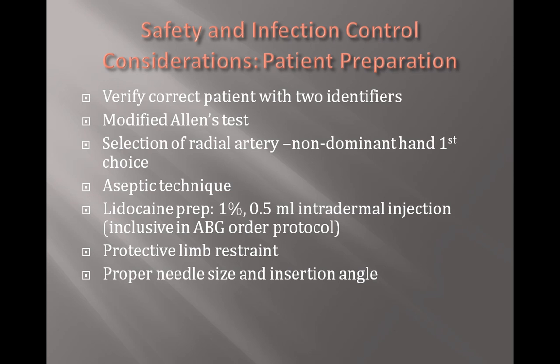So, a 90-degree angle is acceptable for femoral artery punctures, but not for a radial artery puncture. You'll also want to be cognizant of post-puncture care needs and plan accordingly. The primary concern here is to build in enough time to support your patient and maintain post-puncture pressure for a minimum of 5 minutes. Cover it with a Band-Aid and reassess the site a few minutes thereafter.